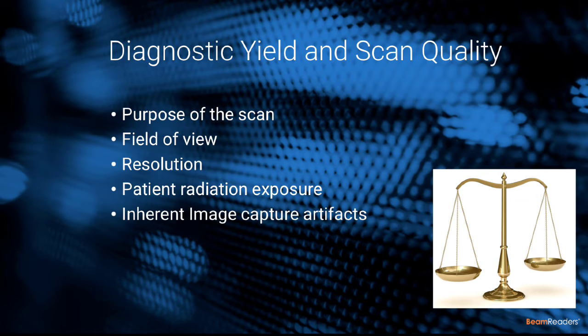Next, we talk about resolution, and resolution is the ability to see 2 things that are very close together and separate them. We need higher resolution when we're looking at something like an endofill, or looking at pathology, or looking at a margin, looking at lamina dura. But there's a give and take here, because the higher the resolution, the more exposure to the patient. Additionally, the larger the field of view, the more exposure to the patient that we see.